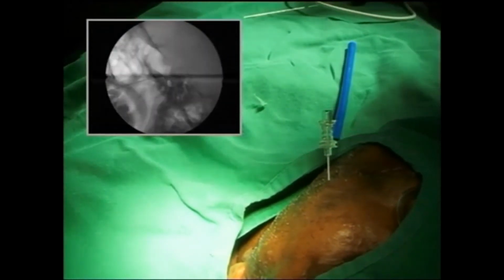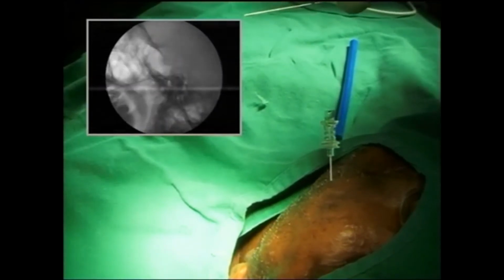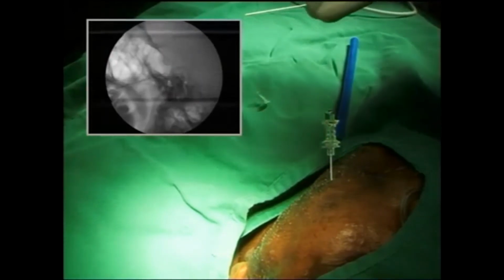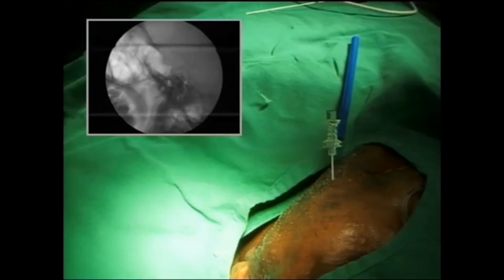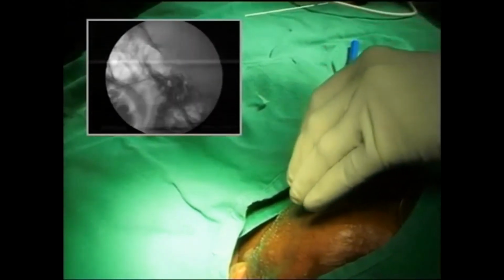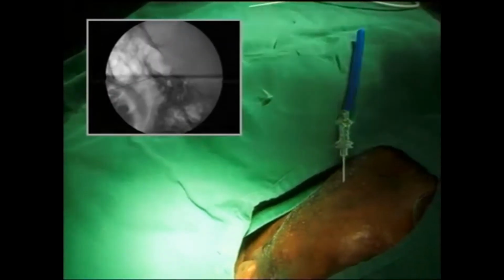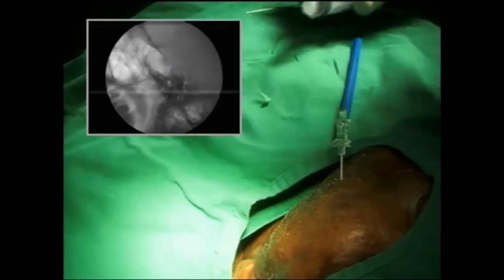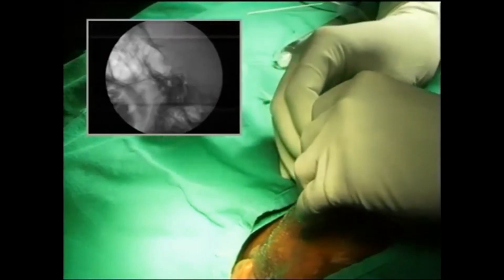Karthik, you don't want to confirm whether you punctured the cistern or not? What is your doubt, Pankaj? I just wanted to ask you whether you have punctured the dura or not. How will you confirm? I'll confirm it. I'll do a negative aspiration, not to worry.